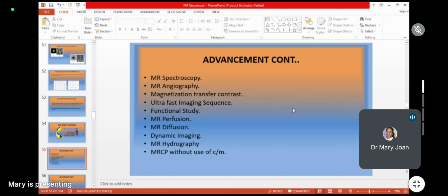Then as the field strength increases, we are able to adjust all these things. We are able to capture all these changes very fast and take information out of that. So the functional information, how the heart functions, how the blood flows, we are able to interpret from the data we acquire by changing one or more of the parameters we apply, and the corresponding results we receive. We say that the functional cardiac information is possible to get from 3 Tesla MRI.